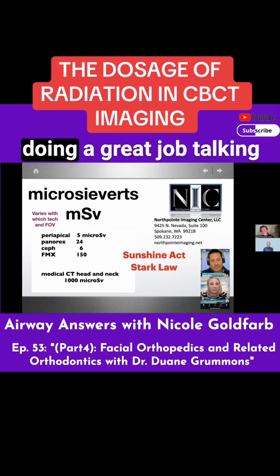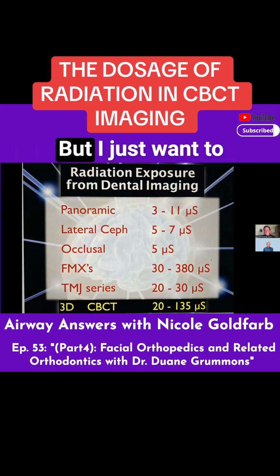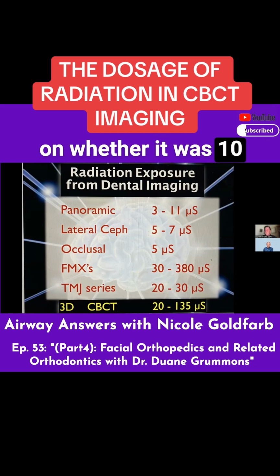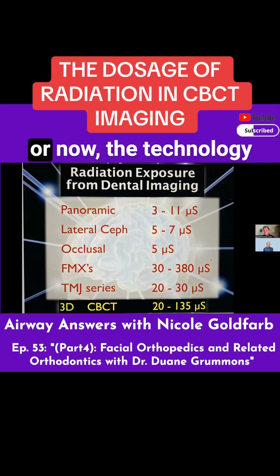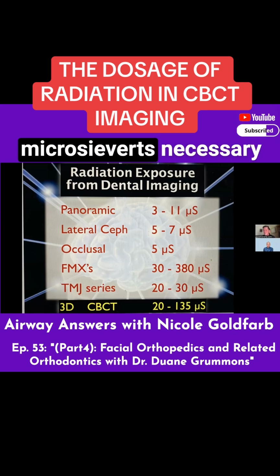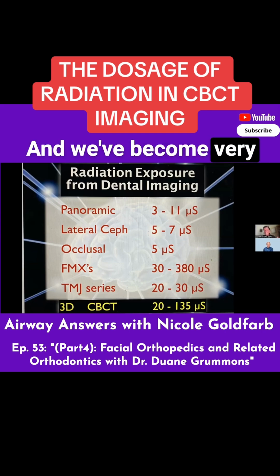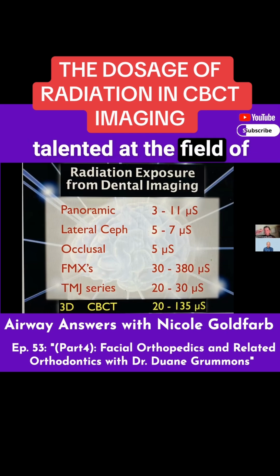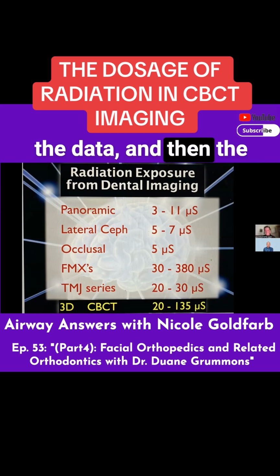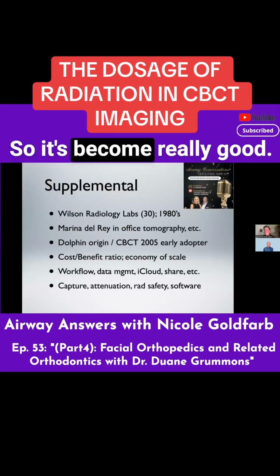So you and Mike are doing a great job talking about these things to help people understand better. But I just want to emphasize, depending on the articles we're reading and depending on whether it was 10 years ago or 5 years ago or now, the technology just keeps getting better. So there's less microsieverts necessary to create the image. And we've become very talented at the field of view we're selecting, and then how we're rotating the data, and then the screen prints we do and how we view the data. So it's become really good.